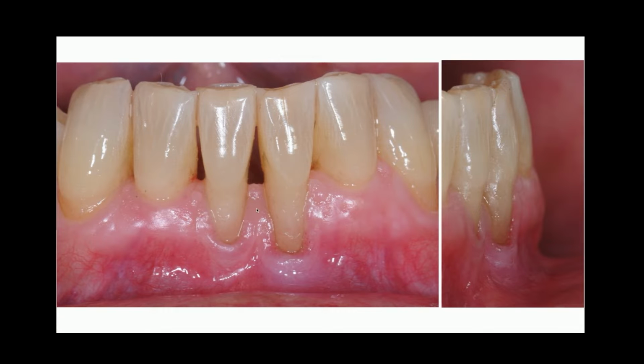So here I wanted to address the patient's request, and I wanted to improve the quality of the soft tissues below this gingival recession. In this case, my goal is to improve the quality of these tissues to make it easier for the patient to maintain oral hygiene and to increase the depth of the vestibule. So the free gingival graft is the ideal technique.